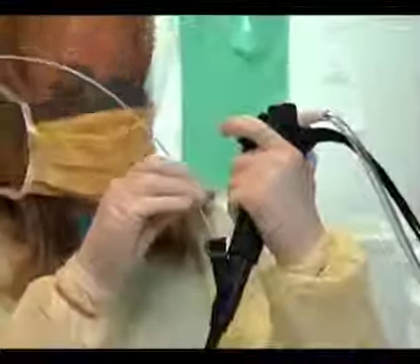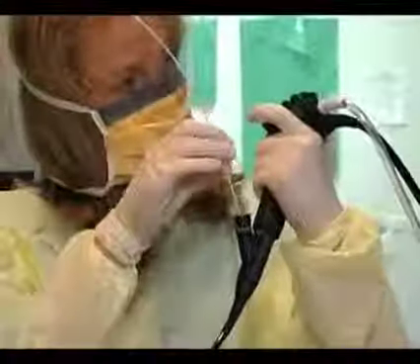And then I know that I'm in it, and at this time I apply suction, securing the scope, and I'm just agitating gently back and forth. It can be in fast motions or very slow, deliberate motions through the mucosa. And I'll do this for approximately 30 seconds, retrieving sample with suction.